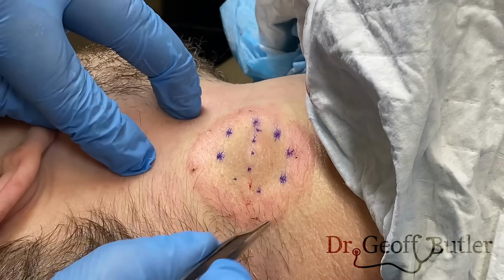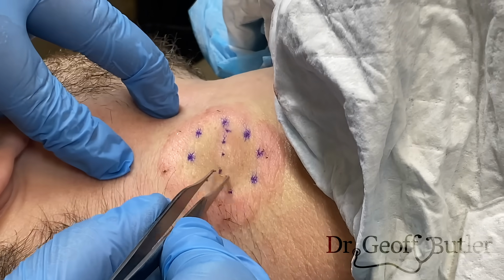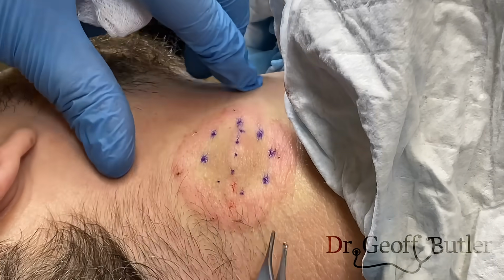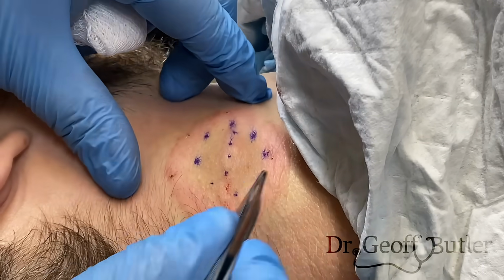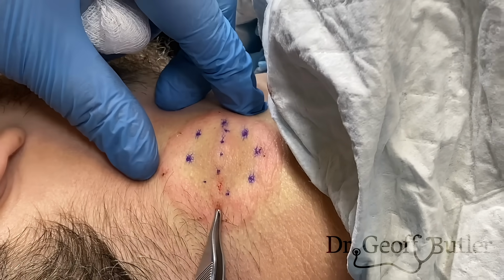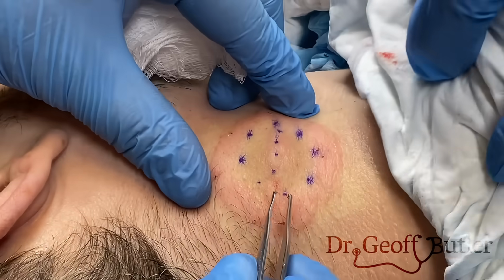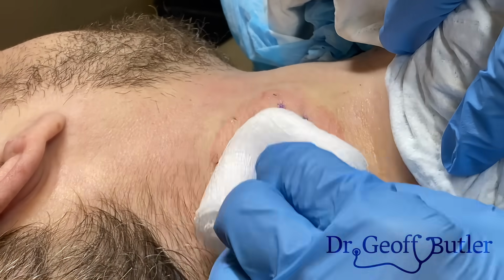We've added the actual 2% xylocaine all the way around and through this. You can't feel that other than pressure, like no pain there. He's a little bit sweaty, so he has an aversion to needles, so this process was hard for him. So obviously he's been told during the procedure if he feels uncomfortable, add some more, but that might be a bit of a challenge for him. So he's got some water in him, he's probably not feeling so fantastic.